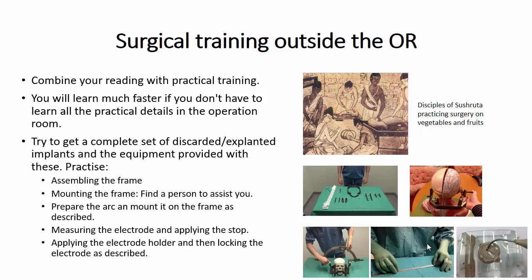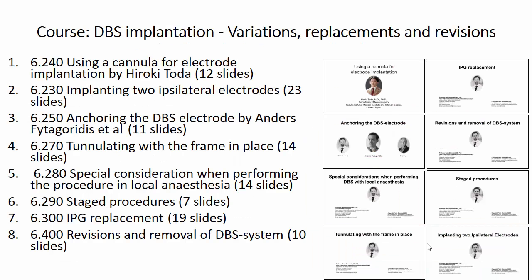So concerning the hands-on training, try to get a complete set of discarded or explanted implants and the equipment provided with these, and practice outside of the OR: assembling the frame, mounting the frame, how to prepare the arc and mount it on the frame as described in the lectures, measuring the electrode and applying the stop, applying the electrode holder, and then locking the electrode.